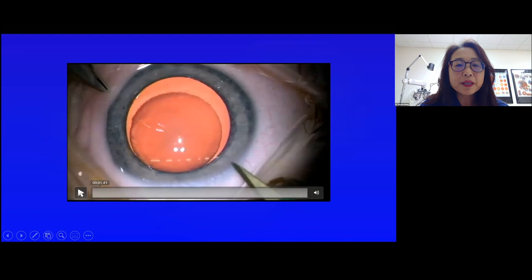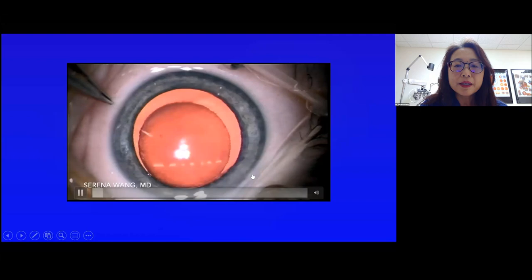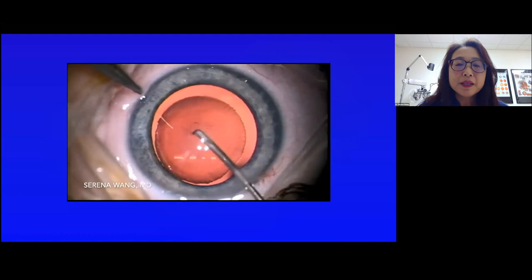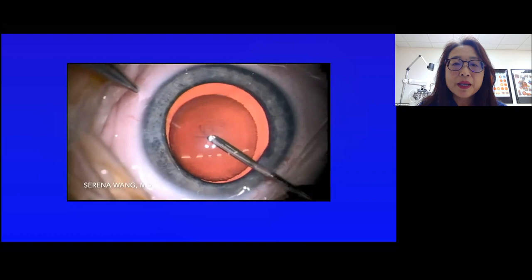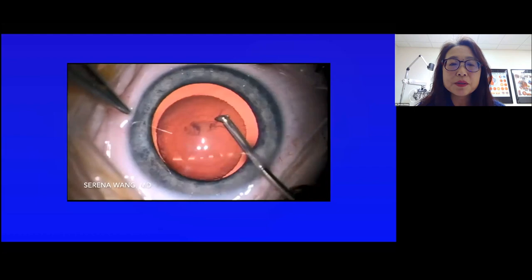Here, I want to show a quick, whole surgery for my IOL case. That super sharp blade opens the wound, and I use Healon, inject it in the anterior chamber, and open the anterior capsule with this cystotome. But if you can use the forceps, already sharp, to open this, you can even save this step. Look, the motion is really push, pull, because those capsules are so easy to tear out, very different from adults.